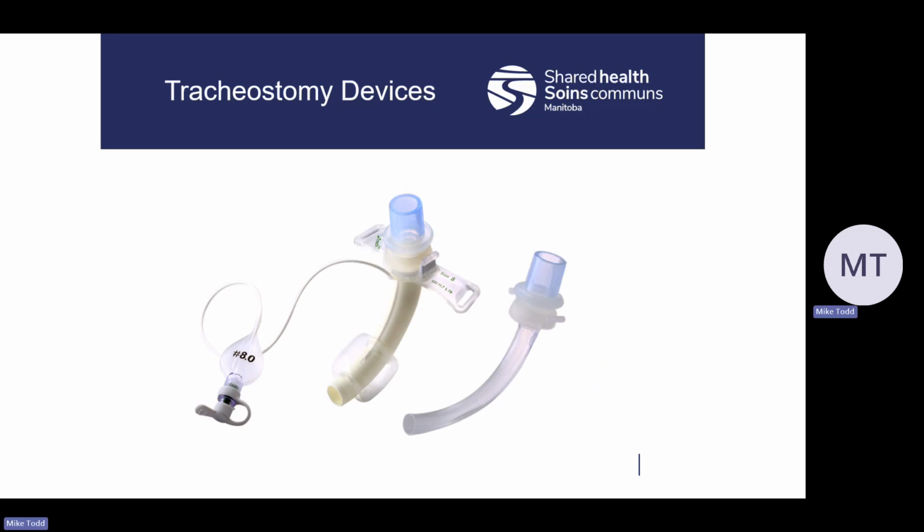So other tracheostomy devices here. We have a cuffless trach tube. This one is a very common device. Patients often self-manage these outside of the hospital. There's a lot less risk of pressure injury or esophageal tracheal fistula from the cuff constantly eroding the tissue because of constant pressure. So it's more common in patients moving towards decannulation without the need of a speaking valve. Cuff trach tube, like I said before, is usually used more so for patients requiring constant positive pressure ventilation or ventilatory assistance, or who can't protect their own airway.